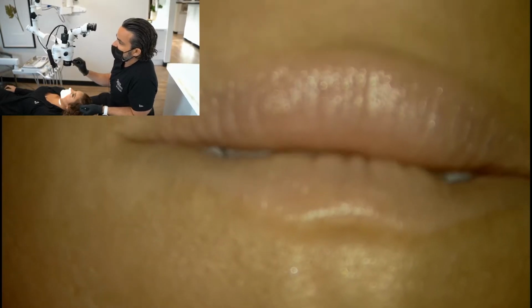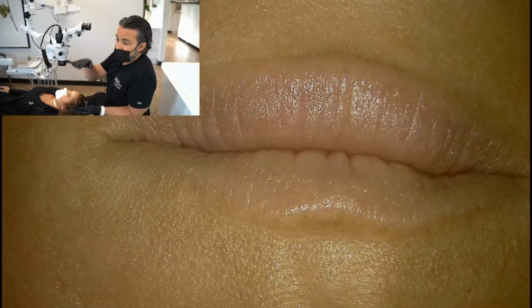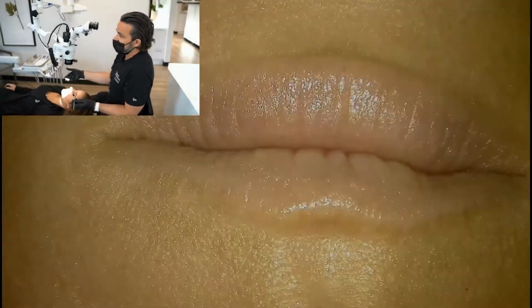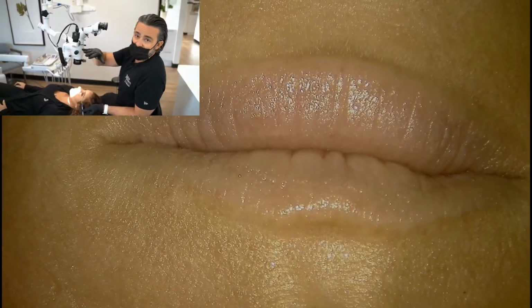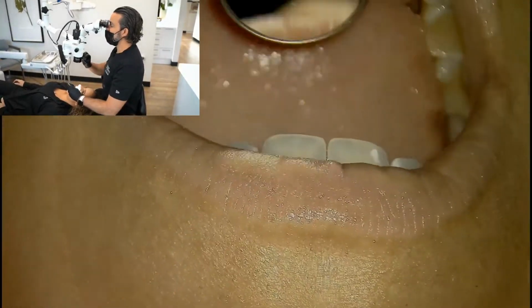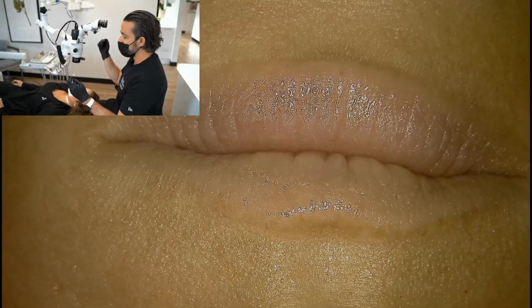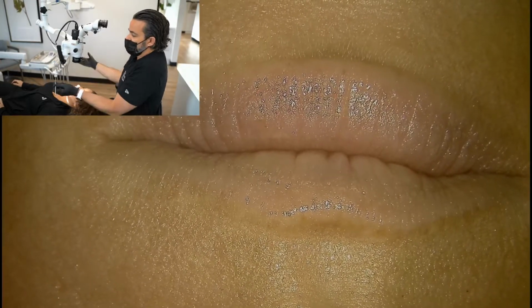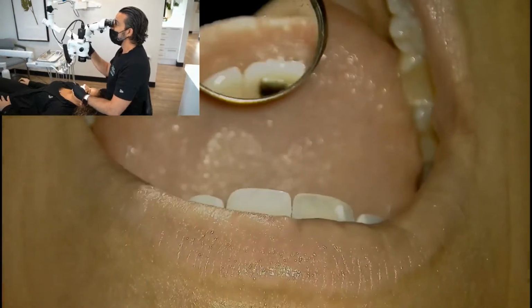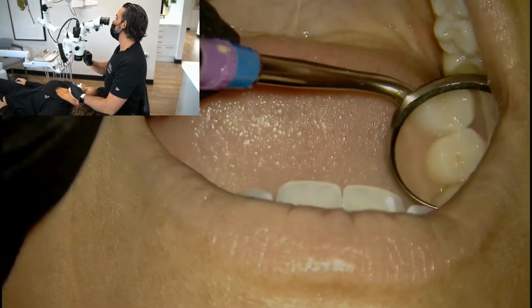And this fine focus is also very important, because as you are higher up at a higher magnification, you actually have a smaller depth of field to stay in focus. So when you go from the anterior to the posterior or the mesial to distal in the mouth, that depth as you magnify shrinks. And so you'll find yourself doing little fine focus like this. And what's nice about that is, when you had loupes, it's the same principle, but with loupes you would figure out by doing this. You would bend. Or you'd try to lift the chair or do something like that. And that's fine, but it kind of is going to give you neck problems. So here, I can always just do this, and always just have a little bit of a tweak right here as you look on the screen.